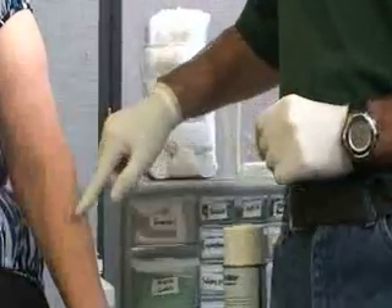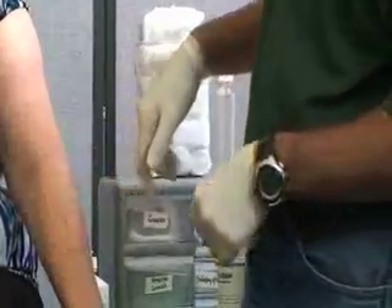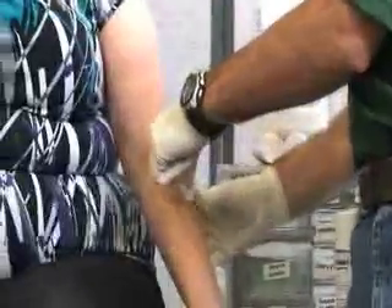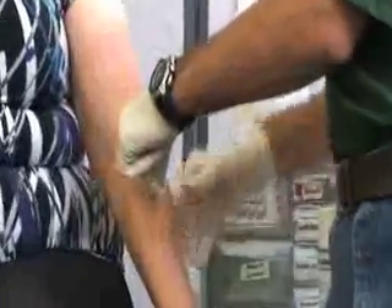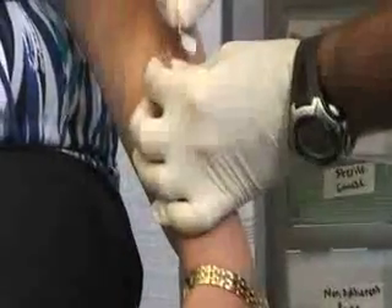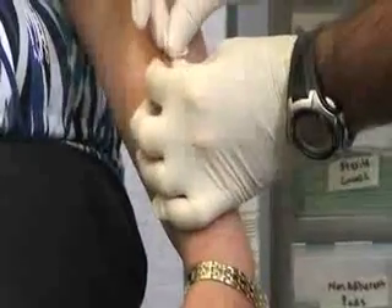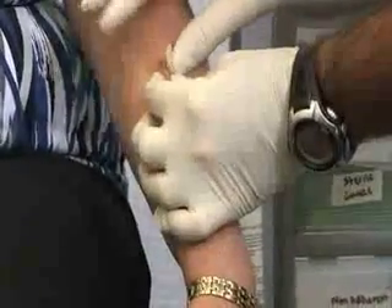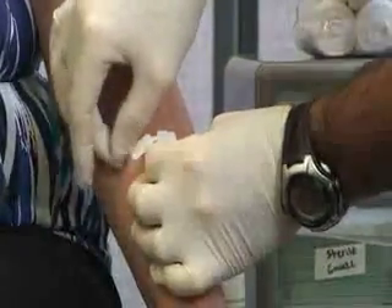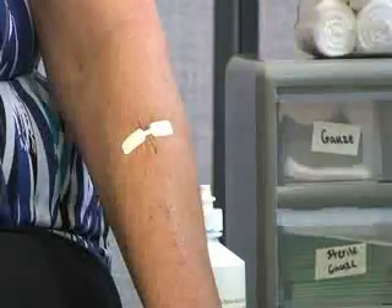When putting on the Steri-Strip, you need to determine how many you need — in this case probably two. You always want to put them on one side first. One important thing when applying is you always want to pinch the skin. Push the two sides of the skin together, and then apply your bandage — it should stick to the adhesive glue you put down on the other end.